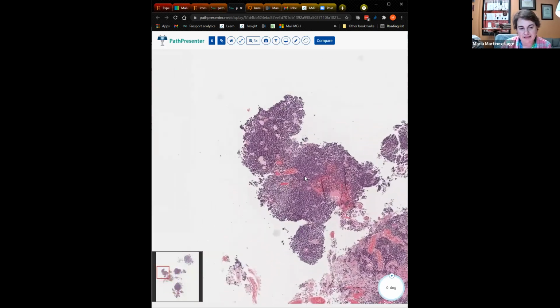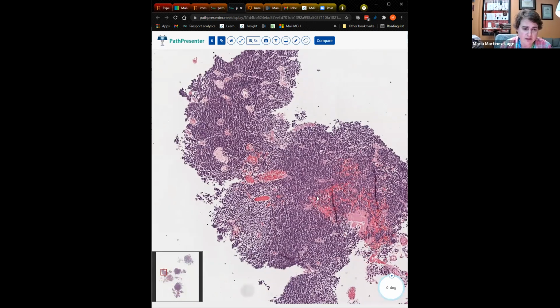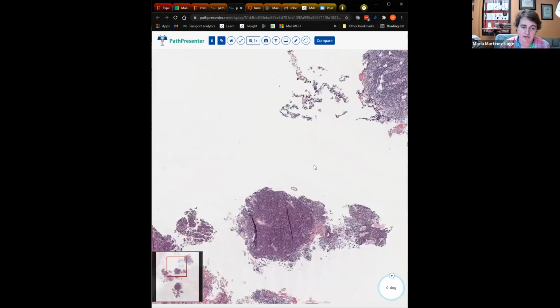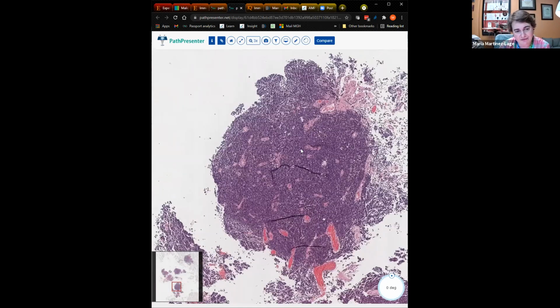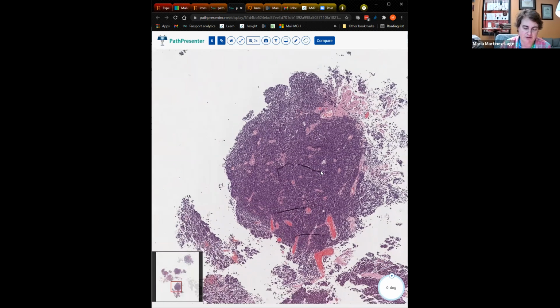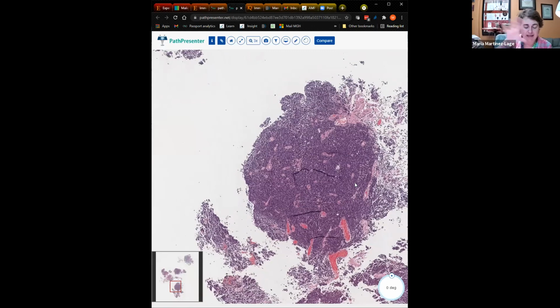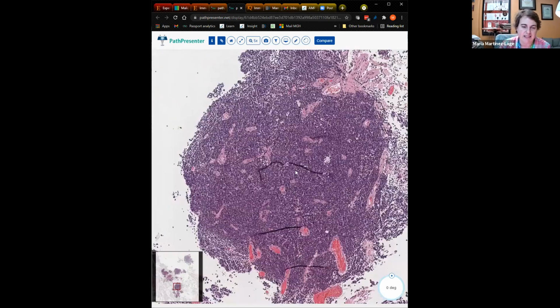So you can classify medulloblastomas histologically, or you can use molecular classification of medulloblastomas. Histologically, there is the classic type, which is something that looks like this, like a small round blue cell tumor that's not very architecturally, it's usually homogeneous. You can have Homer Wright rosettes, but not anything else, meaning there is no nodularity, there is no desmoplasia, and there is no anaplasia. So classic type medulloblastoma would be this. Then we have desmoplastic nodular medulloblastoma, which is actually characterized by the presence of islands or nodules that are typically paler than the background.